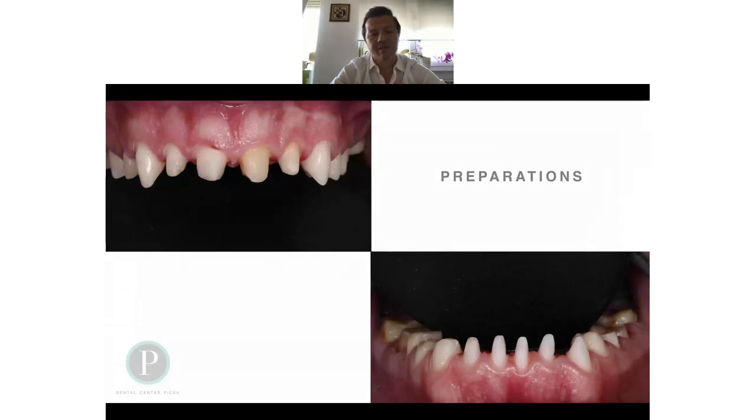His demands and my approach are usually indirect. When there is a situation, do indirect, and you see how clean the preparations, how clean the abutments are now.